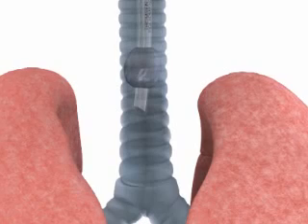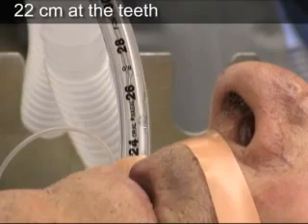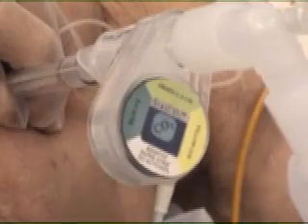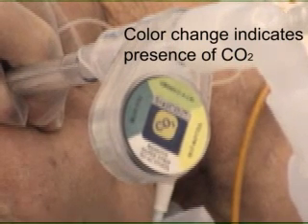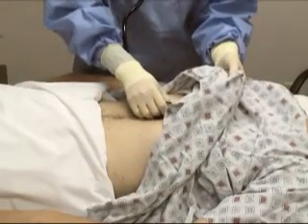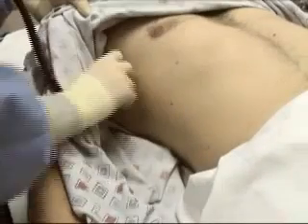The end of the endotracheal tube should lie in the mid-trachea 3-7 cm above the carina. A good rule of thumb is 22 cm at the teeth for the average size adult. Place the end-tidal CO2 detector onto the endotracheal tube and attach the ventilation bag, administering a few tidal volume breaths. Carbon dioxide will be reliably and consistently detected within the first 6 breaths of an endotracheal intubation and with each exhalation thereafter, except in some cases of cardiac arrest when gas exchange may not occur. Assess secondarily for esophageal tube placement by auscultating over the stomach during positive pressure ventilation. Auscultate both lungs in the mid-axillary line to assess for equal bilateral air movement.